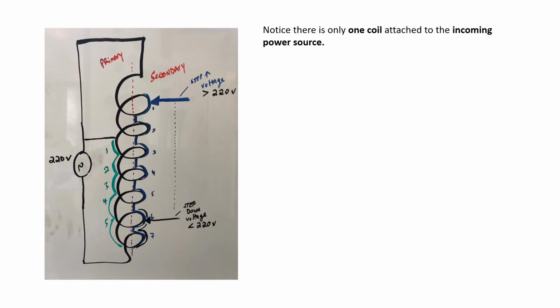Now in older equipment, you don't find this really today much, but in older equipment, when you would turn a dial and go from one kilovoltage to another, it would make a very unique sound. It kind of sounded like this. Zzz, zzz. And basically what that was is the point of contact either moving up or down on the autotransformer.